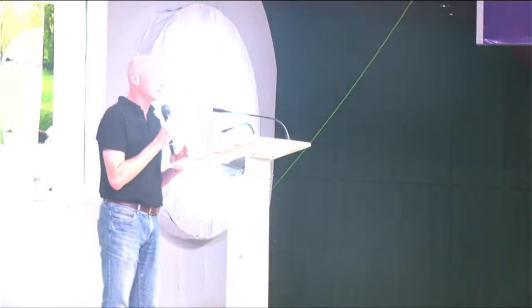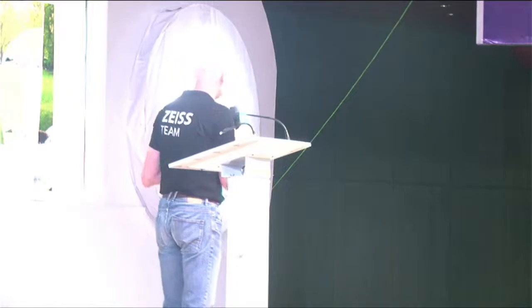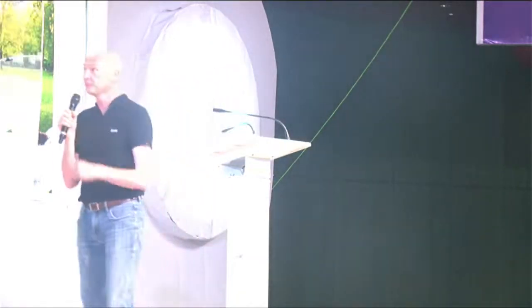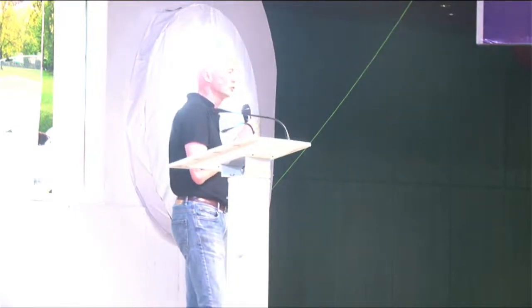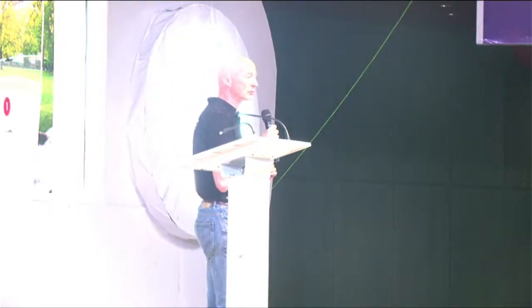In Zeiss, we do it differently. We work the other way around. We are hard designed lenses. So in hard design, we make that far area as big as possible in the optical world for a certain correction, for a certain frame. And the same for the near area. We will make it as large as possible. That's the main advantage. It has also a disadvantage.